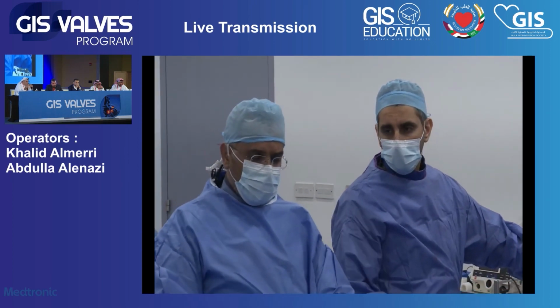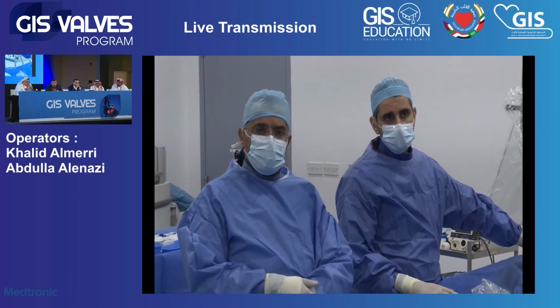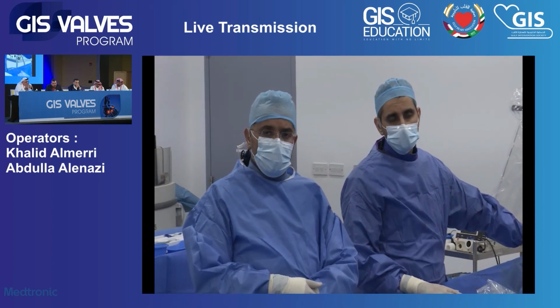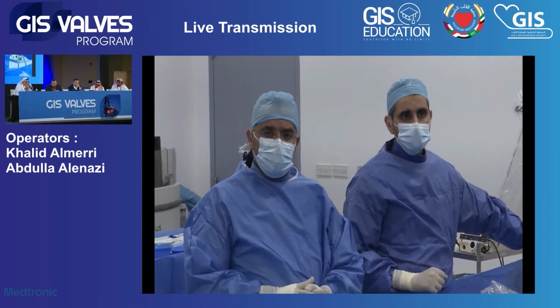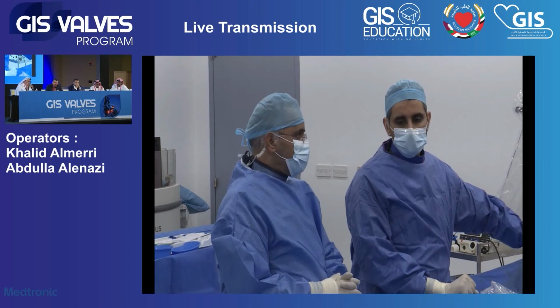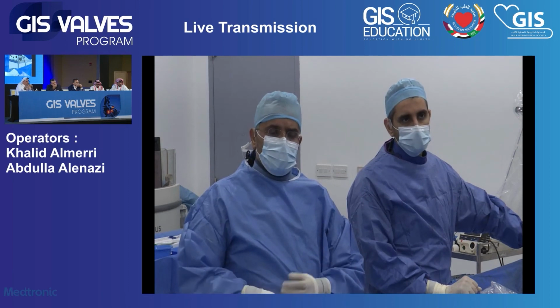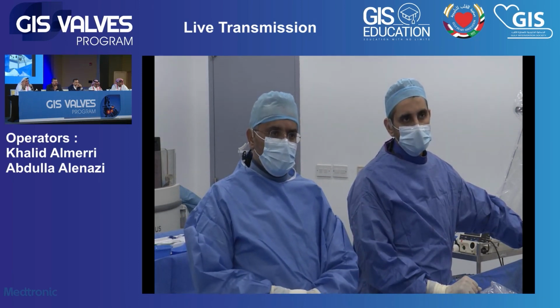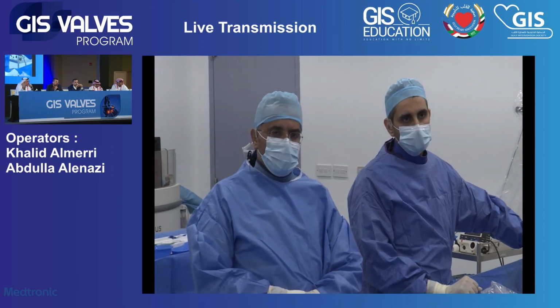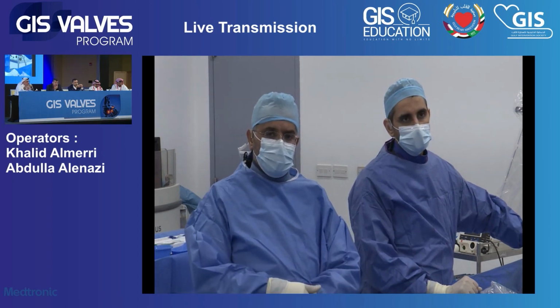Actually, what our surgeon was mentioning, since the surgery was done in 2008, according to the history that you have presented, is whether it is a single leaflet or double leaflet, so that also reduces some of the concern. If it's single leaflet, it is deeper, the profile is larger, and if it's a thin or double leaflet, it has less profile and less concern about complications. So it's good always to listen to the surgeons and their comments beforehand. I was really interested and excited to hear from them. That's one of the points that our team can add, additional information that we sometimes miss as interventionalists. Thank you. Sure.